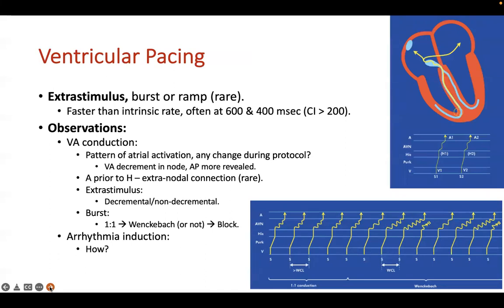So usually people prefer ventricular pacing for that reason. Plus, when you ventricular pace, you will have an idea whether there is an accessory pathway or not relatively quickly, and then the flow of the case would be easier. You can do it whatever way you like, but most people will start with ventricular pacing, and this is also the case in our chest disease hospital.